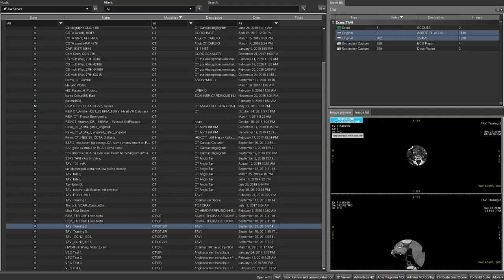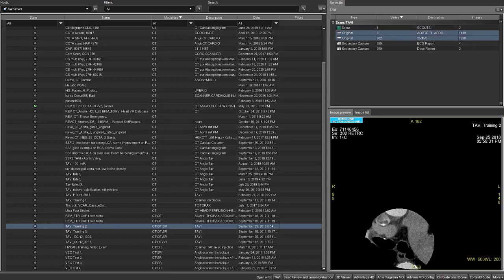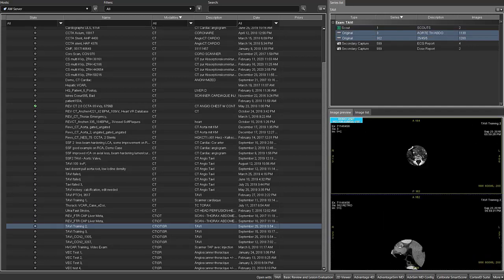This video tutorial focuses on the first steps of the valve definition, from annulus definition to aorta angulation. In order to start, select the patient exam on the worklist browser and select the applicable series. We select two series in this example: one for the valve measurement, which is a multiphase one, and one vascular application to define the vascular access. Then select the TAVI application from the shortcuts.